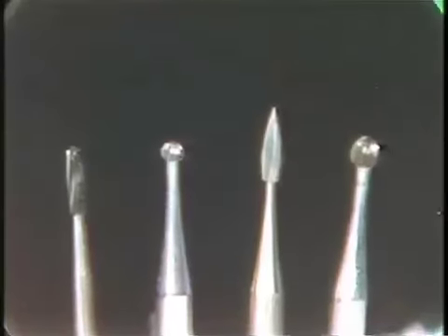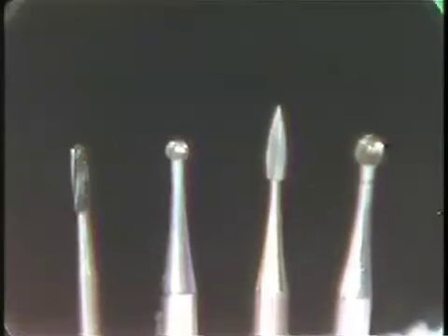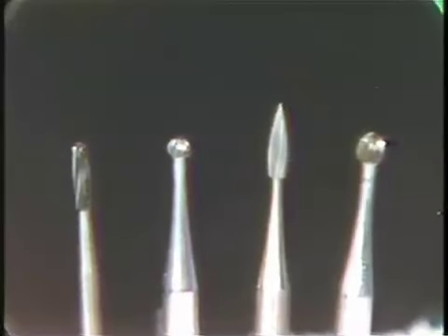The burr on the left is the Kerr 1057 rounded end burr. We use this one to make our initial penetration through the enamel and establish our tentative outline form for all teeth. The next burr is the number 4 round burr. With this burr, we go directly to the pulp and use this burr to unroof the pulp chamber in all anterior and bicuspid teeth.